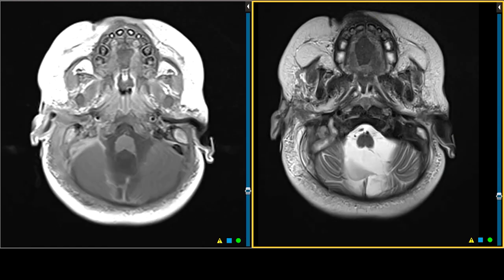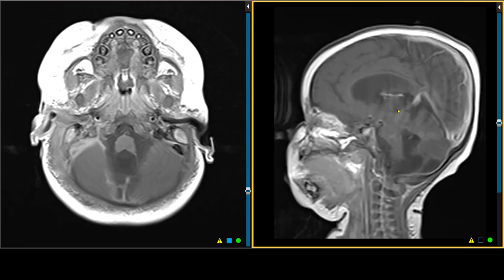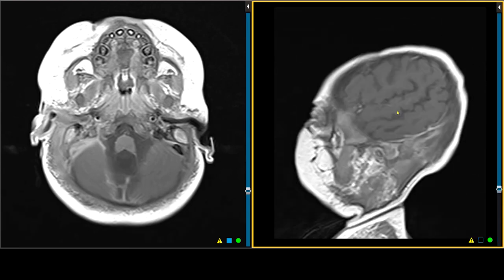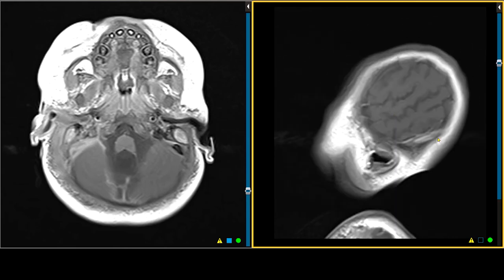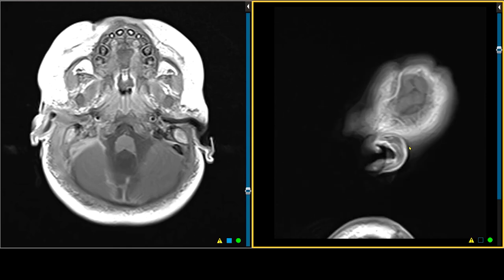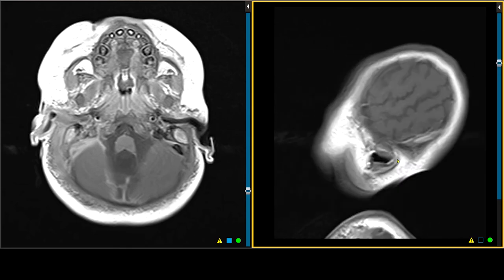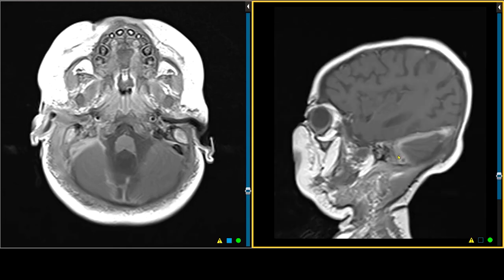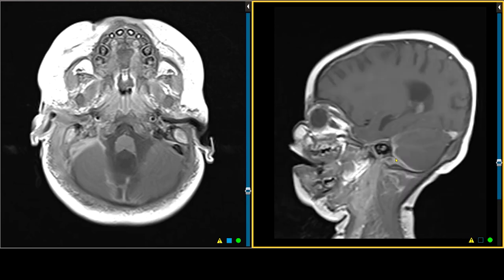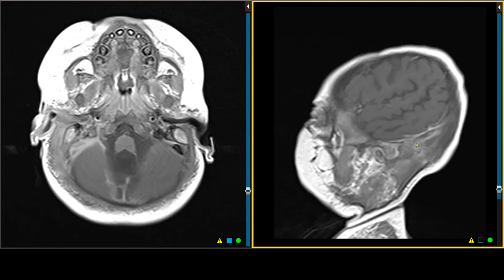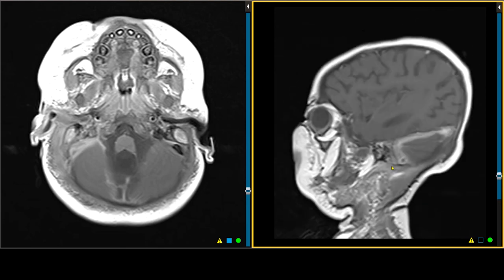Let's quickly look at the sagittal image, because it will nicely demonstrate the inflamed jugular vein. This is the normal sigmoid sinus and jugular vein on the left side. On the right side, you have all of this thickened tissue from the otomastoiditis, and you have the clot within the sigmoid sinus going into the jugular vein below.